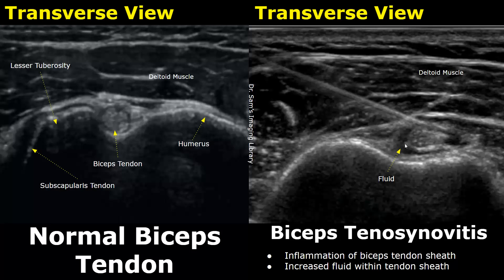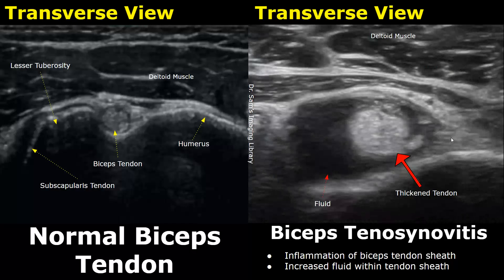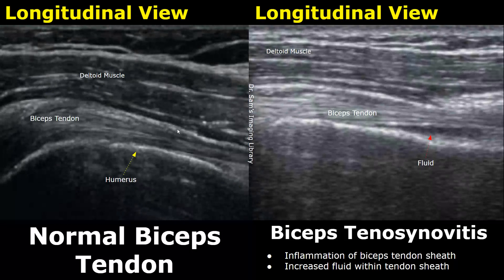Biceps tenosynovitis is inflammation of the biceps tendon sheath. In this condition, we will find increased fluid within the tendon sheath. Here is another image of tenosynovitis showing a large amount of fluid within the biceps tendon sheath. Here we see the normal biceps tendon in longitudinal view, and over here we see tenosynovitis in longitudinal view with some amount of fluid within the tendon sheath.